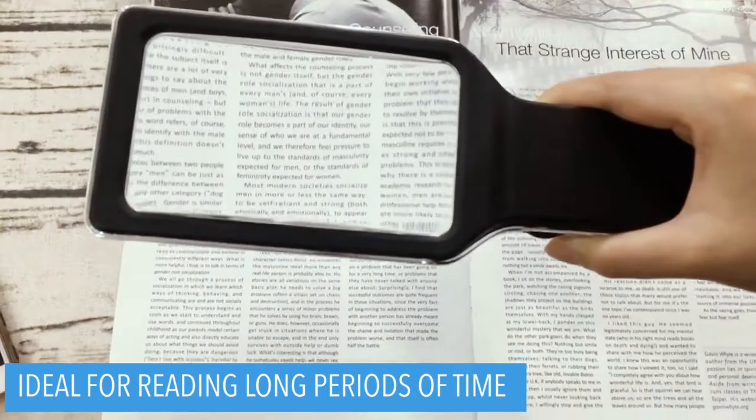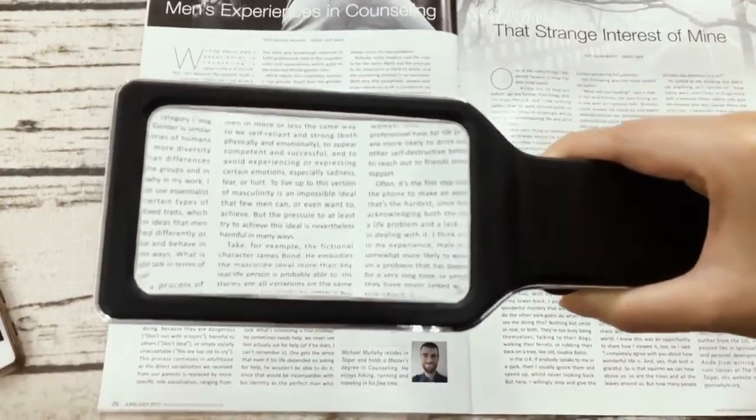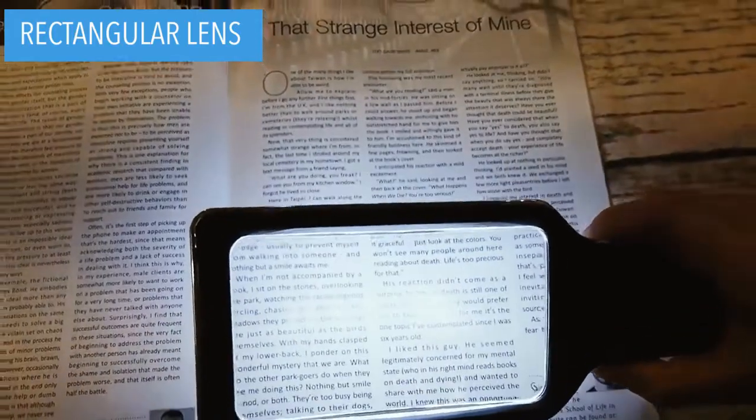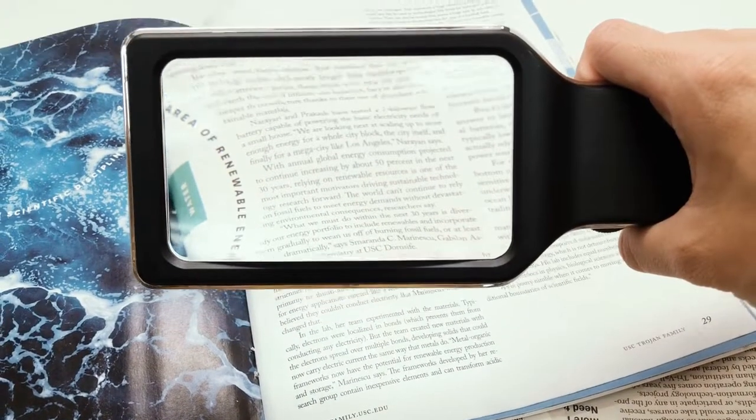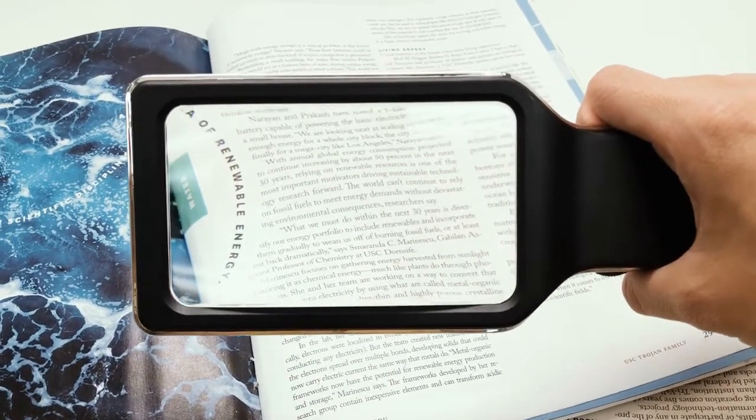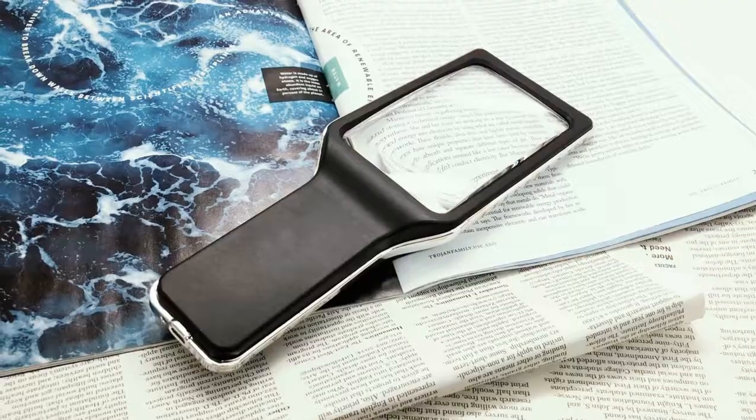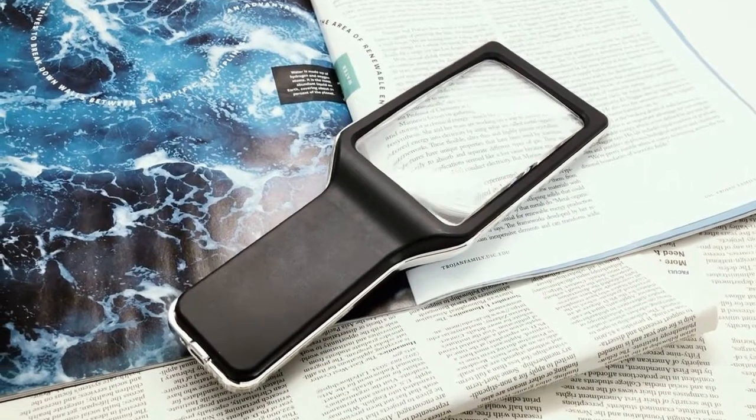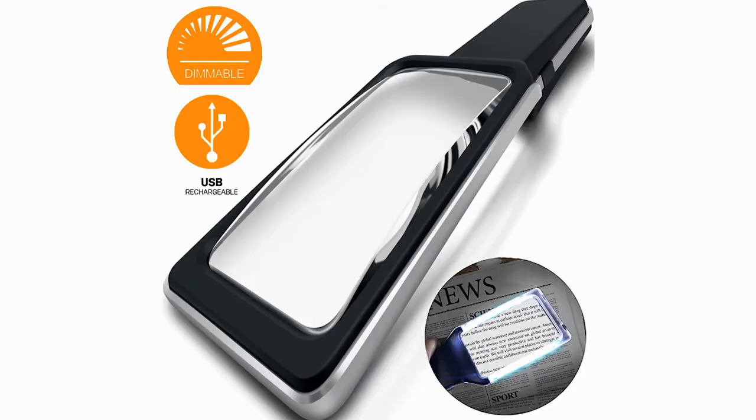The rectangular lens is especially designed to simulate the way we naturally view things from left to right. The magnifying lens covers large viewing areas without having to move your hands all the time. With its new and improved qualities, this rechargeable large handheld magnifier can help anyone.